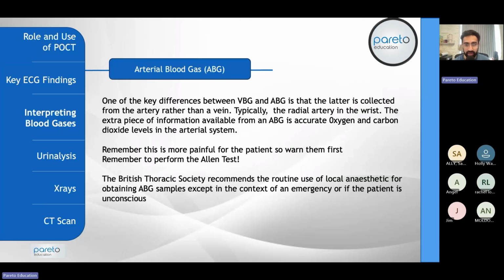The BTS recommends routine use of local anesthetics for obtaining ABG samples. The majority of the time when you do an ABG, you are doing it urgently. The indication is pretty urgent, and therefore very few people have the time to use local anesthetic in that scenario.